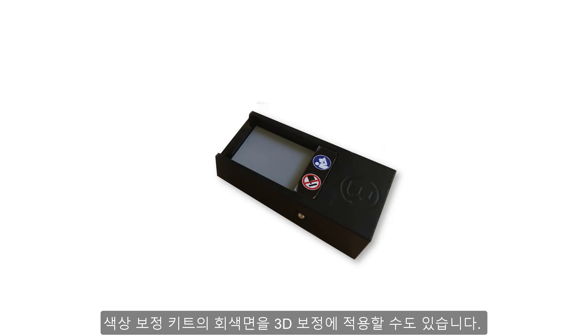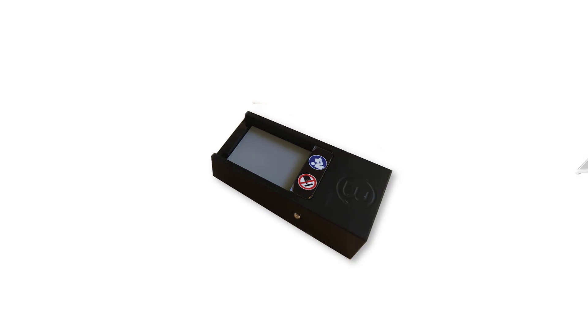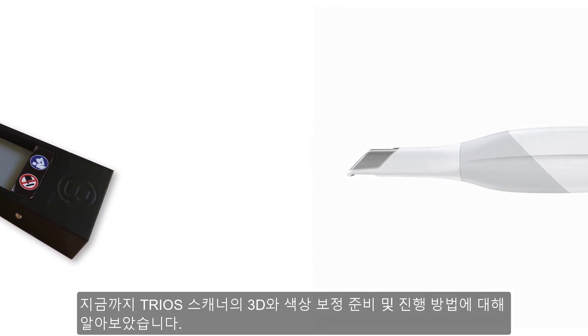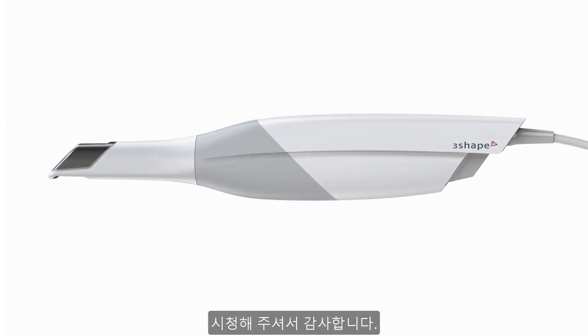The gray side of the color calibration target can also be applied for 3D calibration. For this purpose, simply follow the steps described for the validation part of the color calibration. Now you know how to prepare and perform 3D and color calibration of the TRIOS scanner. You can also find this information in the relevant section of the user manual. Thanks for your attention.